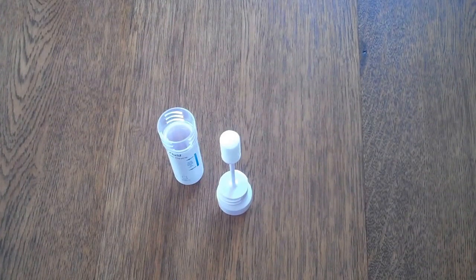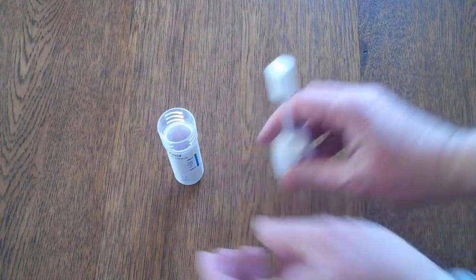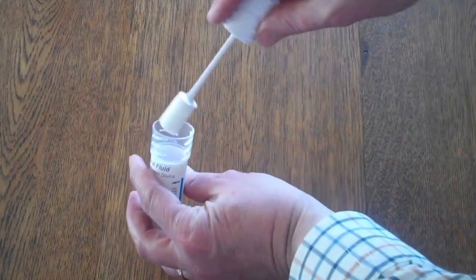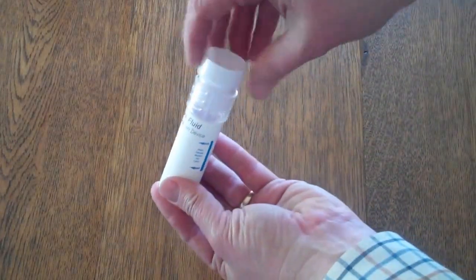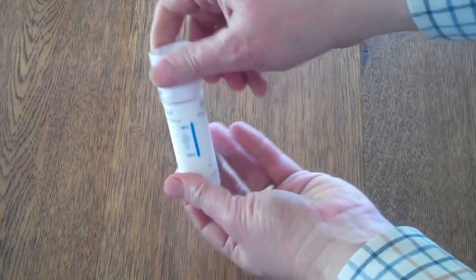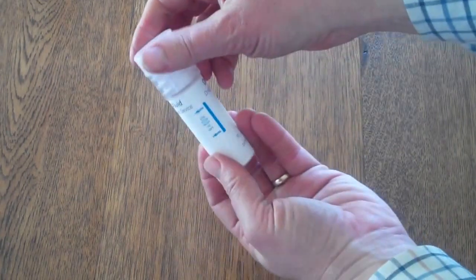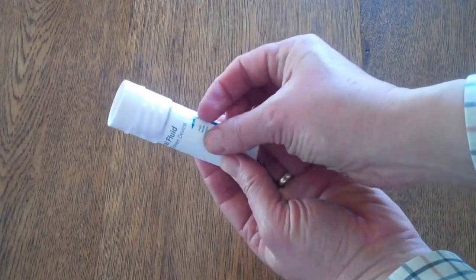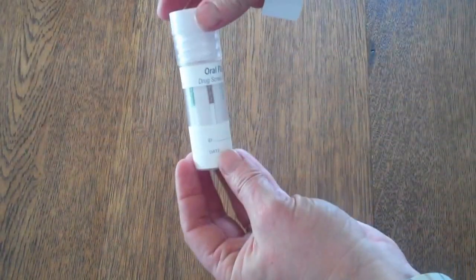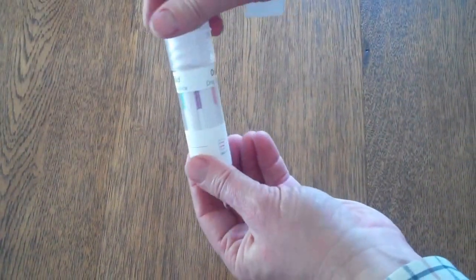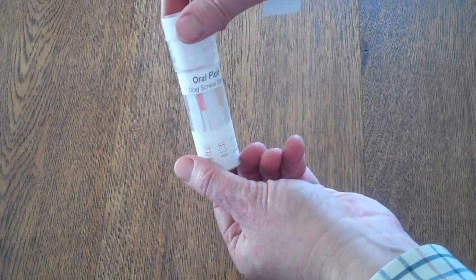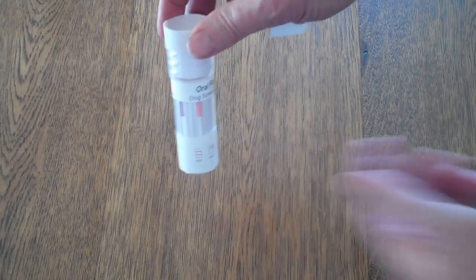So to perform the test now, it's very easy, the two parts of the test are simply combined, tightened and screwed down and then this panel here is removed to reveal the six drug strips that are embedded into that swab.